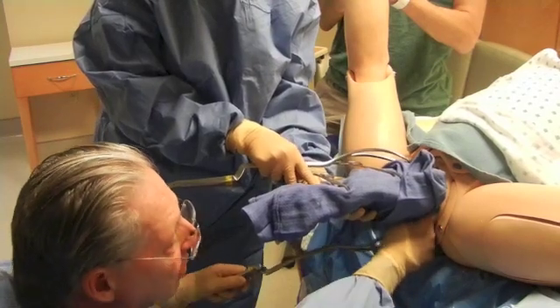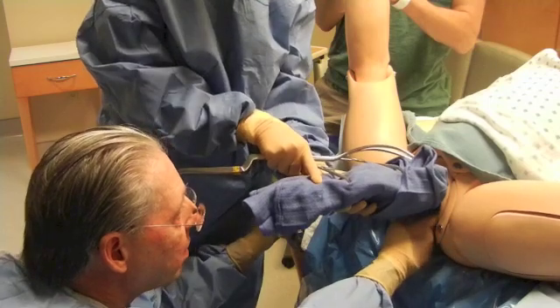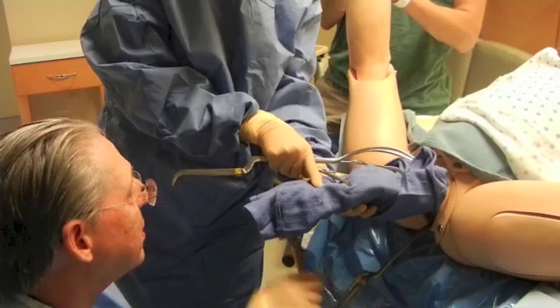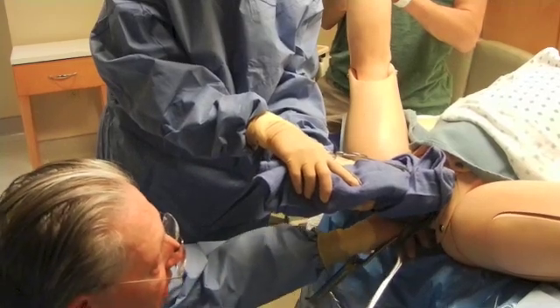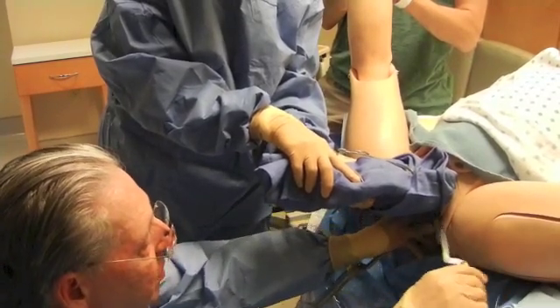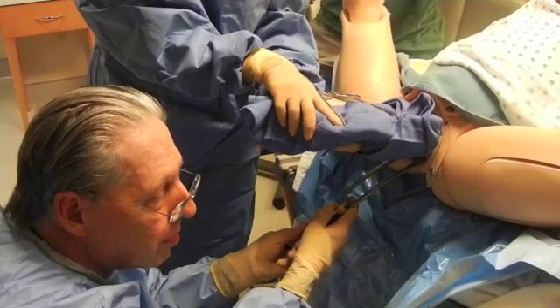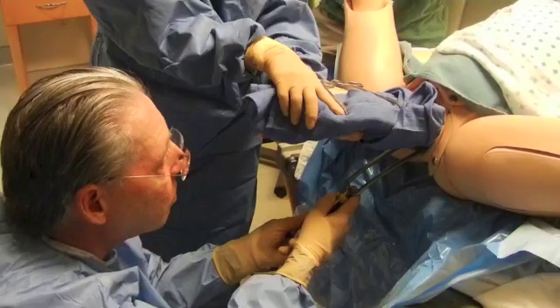There is always a space between the head and the shoulder, so although the cervix may be clamped down, there is always that space. Find the cervix if it's there, slip the blade up inside, and articulate the blades. This is a pelvic application — it doesn't matter if the head is turned left or right.